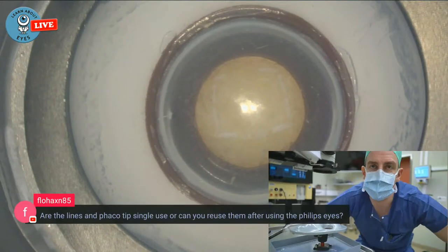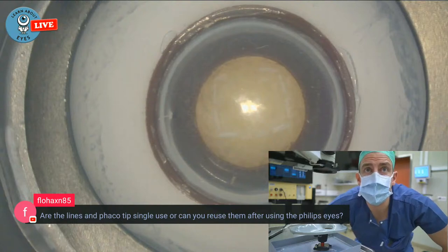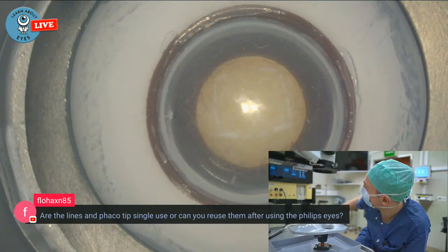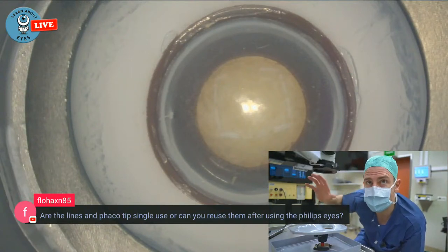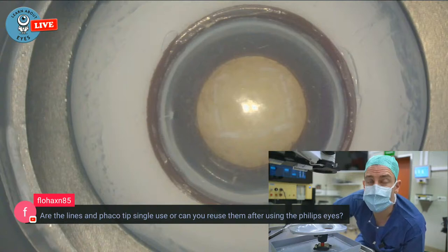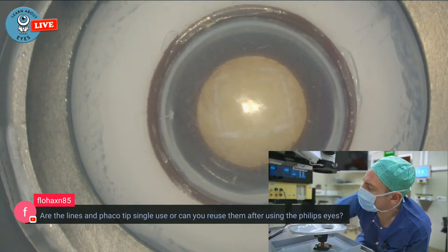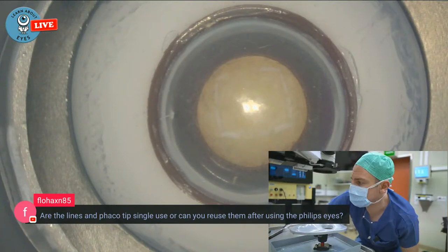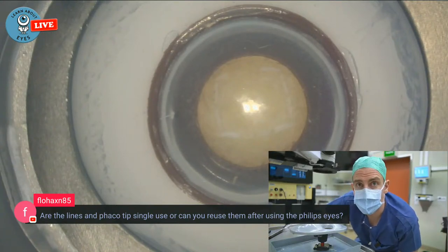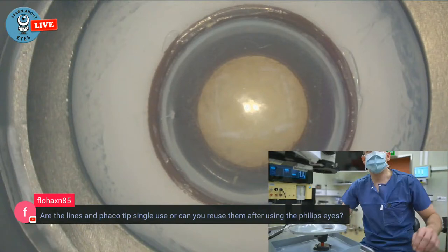And then this other question. Are the lines and phaco tips single use, or can you reuse them after using Phillips eyes? Oh, sorry. Yeah, so the cassette and the phaco tip and everything, you can reuse those every time you practice, but definitely not on a patient. But here, it's not a problem. You can use them. I have used materials here in my box anyway, so you can use them. No problem.